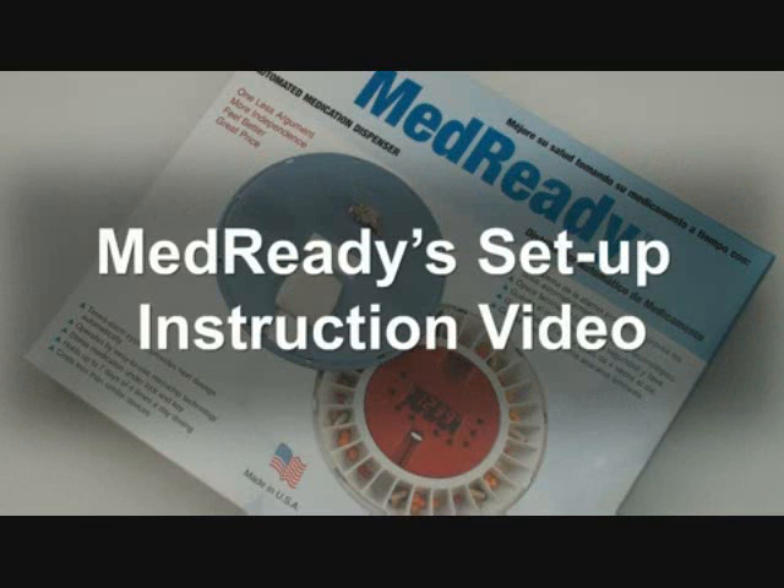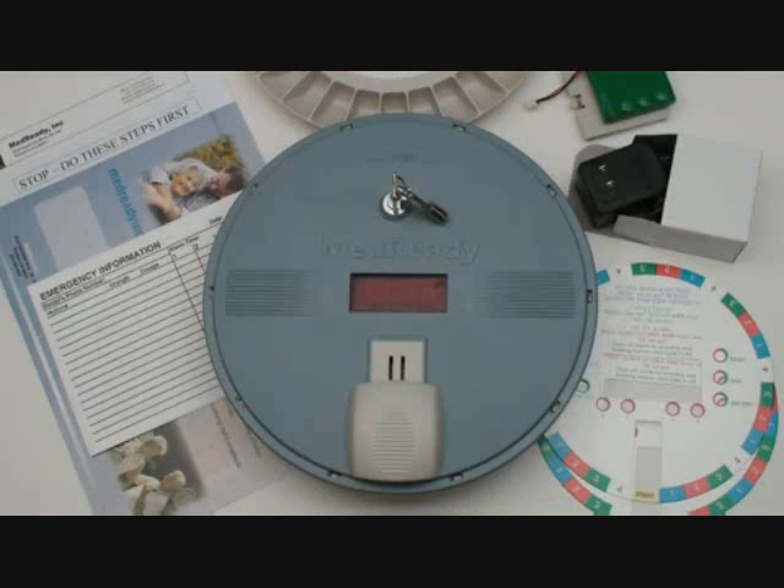Welcome to MedReady's automated medication dispenser setup instructional video. MedReady comes complete with everything you need and setup only takes a few minutes.